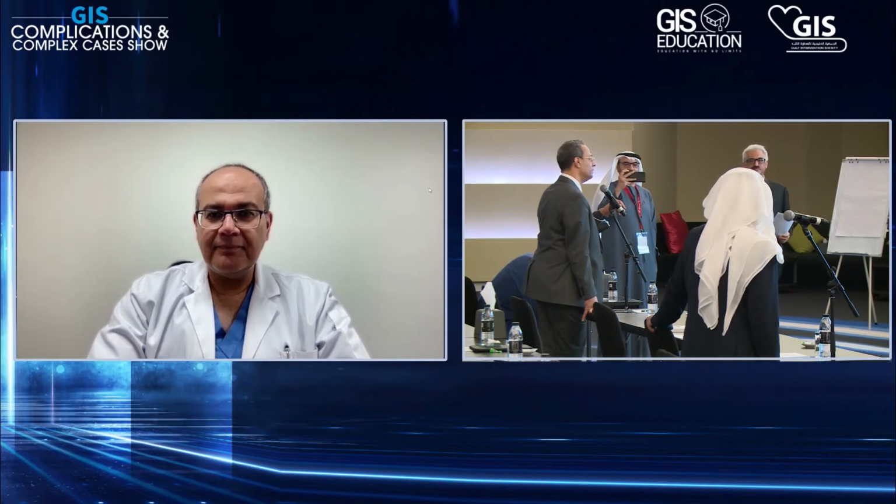Definitely it was his chance to go after this bad CT of COVID pneumonia and then all these complications over all these years, this is a very fantastic result. The point is that sometimes when you're pulling back the stent it comes out easily, and I think snare is a good idea to try to get it, because I think it needs post-dilatation. The stent always needs post-stent deployment sometimes. If it can come back easily, you can try. Otherwise you choose the second choice, that you need more dilatation after putting this malpositioned stent.